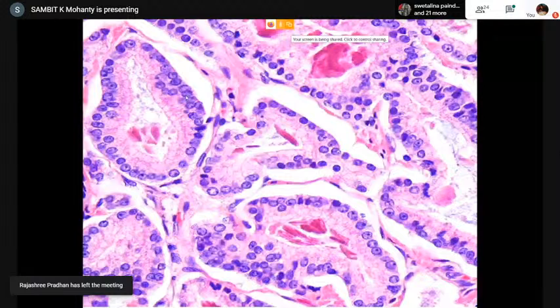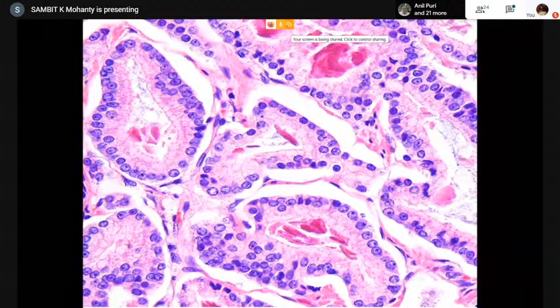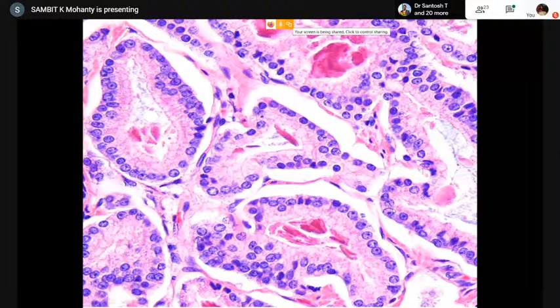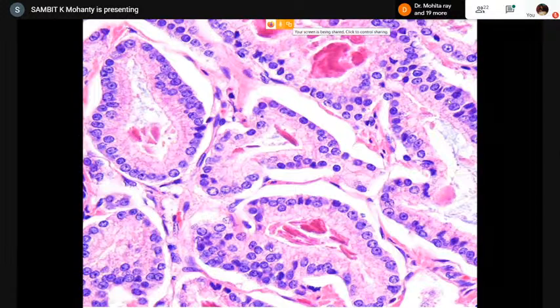So is it malignant or benign? I do see nuclear enlargement, vesicular kind of nucleus with some finely dispersed chromatin, and usually they're dispersed towards the periphery, to the nuclear membrane. But traditionally, by textbook teaching, the fundamental thing is the loss of basal cell layer. But here you have 2 layers. Here also 2 layers. It may be a tangent, but here it doesn't look like a tangent. So why are there 2 layers?